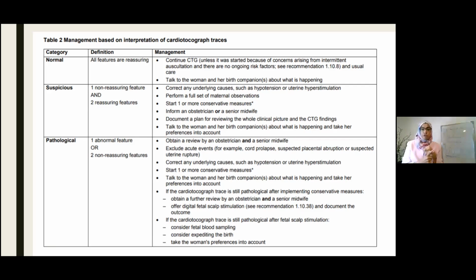So either you're not monitoring the baby, and unfortunately I can tell you many cases when we were actually putting the CTG on dead babies, and the line that we had was actually the mother's pulse, giving us a nice squiggly line. And that's why this feature was built into the CTG, to tell us, hang on, something is not right because the lines are mixing and you might not have got the baby. So that's when it alarms.